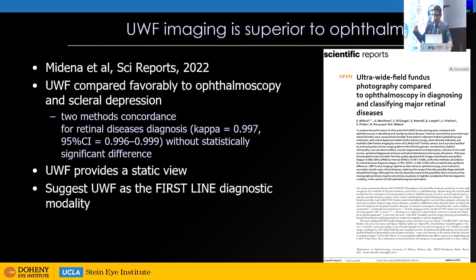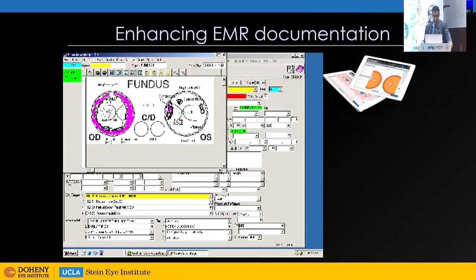And this is where I very much agree with Dr. Vatsal that having peripheral OCT actually does get us to that point now. Because now, not only do you get the entire image, you can actually study those areas to see if there's traction. And so I would tend to agree with the conclusions of this paper now, as I'll highlight.